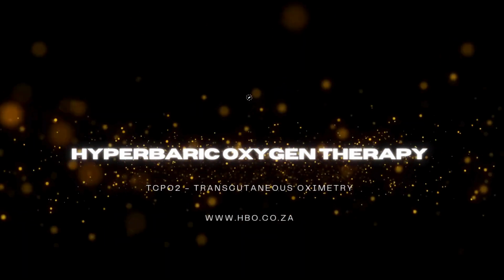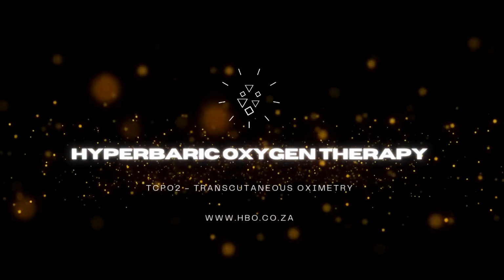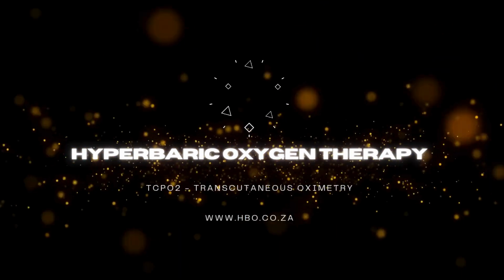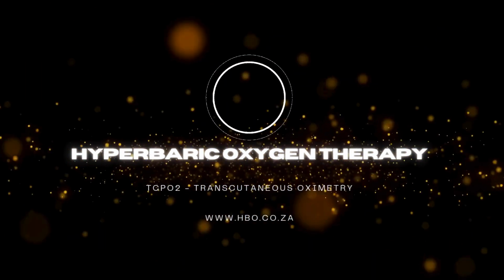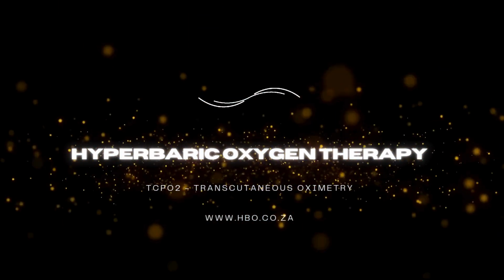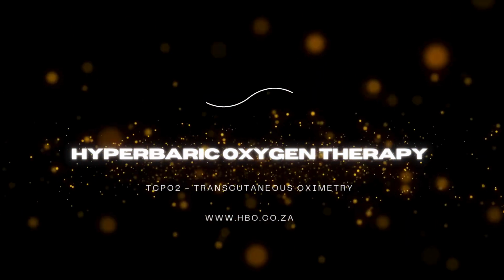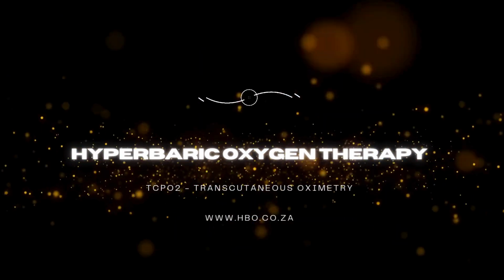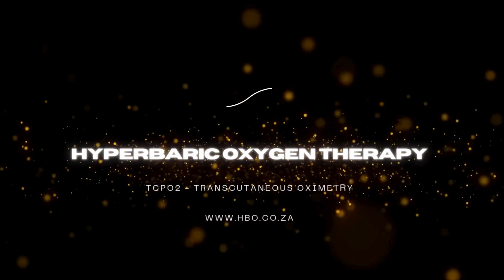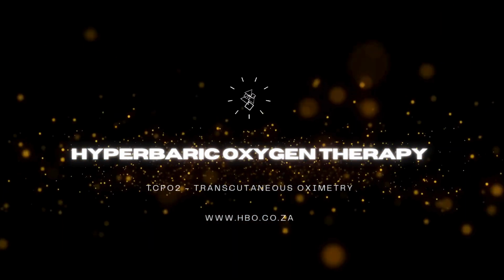Exactly. And we mentioned before, but getting that electrode heated properly and consistently, it's absolutely vital for accurate readings. If it's too cool or too hot, your numbers are off. Consistency is key. Totally. And maybe the biggest conceptual point, TcPO2 tells you about oxygen delivery to the tissue, reflecting perfusion. It doesn't directly measure oxygen inside the cells or tell you anything about how the cells are actually using that oxygen, the metabolic activity. Right, so it's a crucial piece of information, perfusion and delivery, but it doesn't tell the whole cellular story. It needs context. Precisely. You always have to integrate the TcPO2 reading with everything else you know about the patient, their clinical picture, other tests, how they're responding overall.